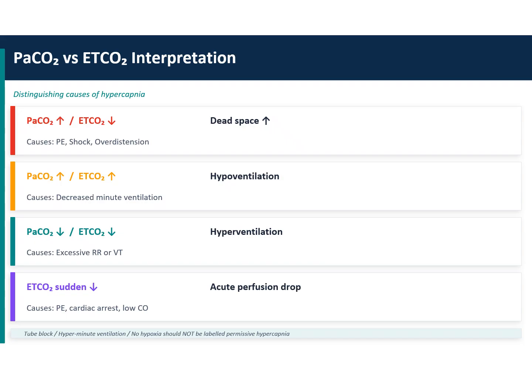So how are you going to diagnose these things? You can use the CO2 gap, which is nothing but the EtCO2 and PaCO2 gap. If it is more than 10, then there is a problem with the pulmonary vasculature or right ventricle. So either there is a thrombus, or the pulmonary vasculature is getting compressed with a high PEEP which you are giving, or the RV is failing, or the patient's cardiac output itself is very low. So these are the situations which you have to troubleshoot. So the EtCO2 and PaCO2 gap is very important. If both PaCO2 and EtCO2 are rising, then you know that the problem is with the airway, and you have to deal with the airway.